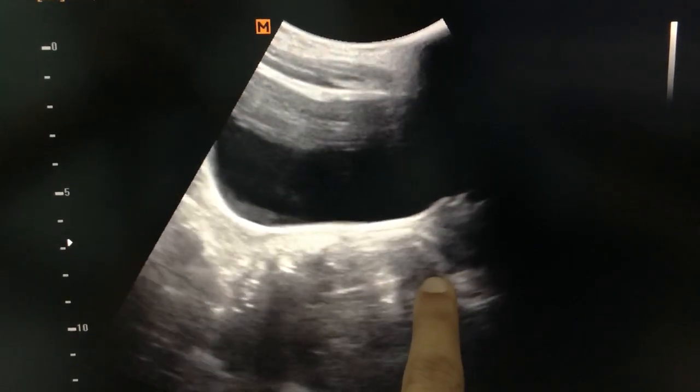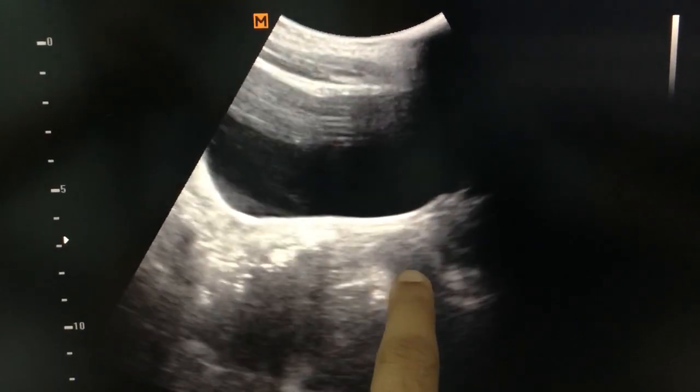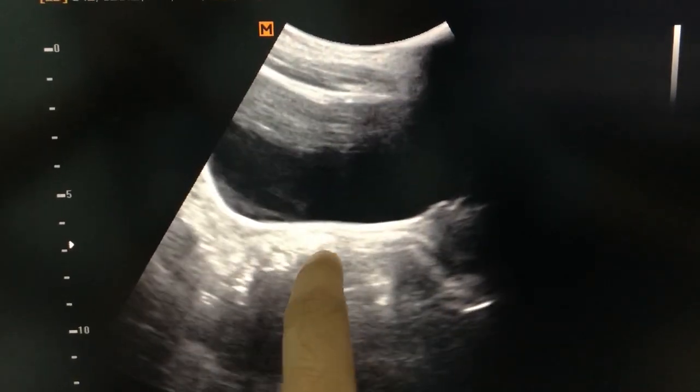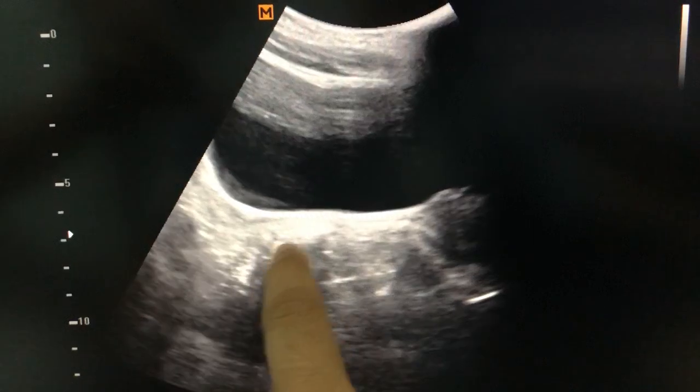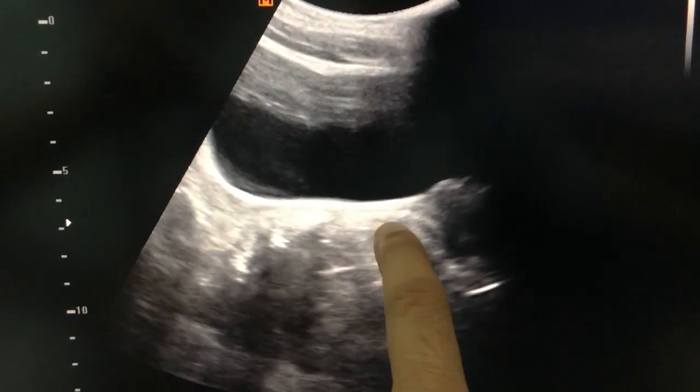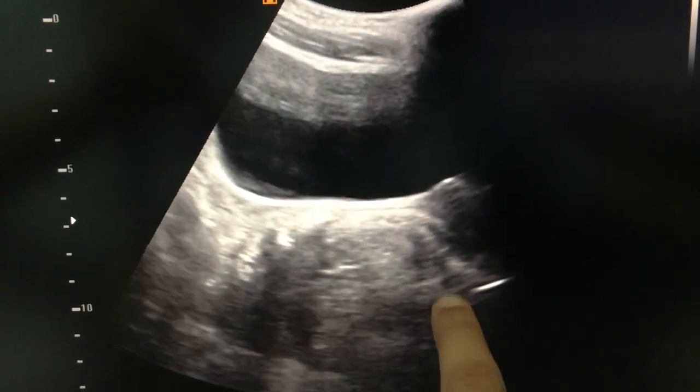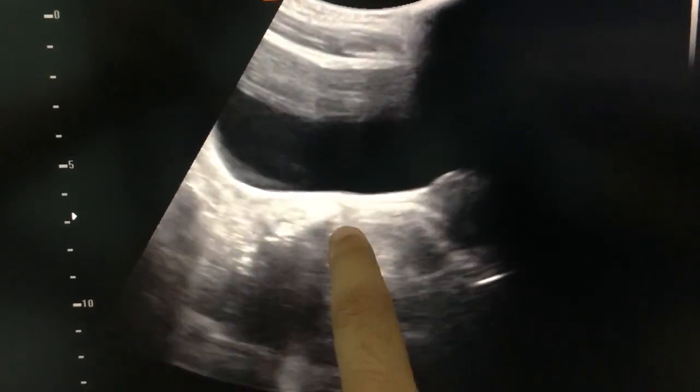These are the bowel loops, rectum, because it is diverting towards the inferior side.